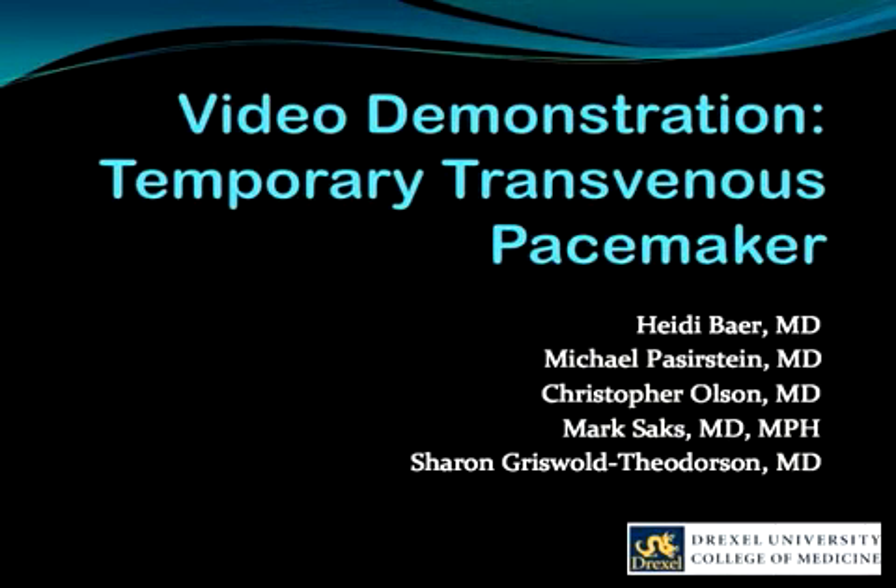Welcome to Drexel and our video demonstration. This video demonstrates the insertion of a temporary transvenous pacer.